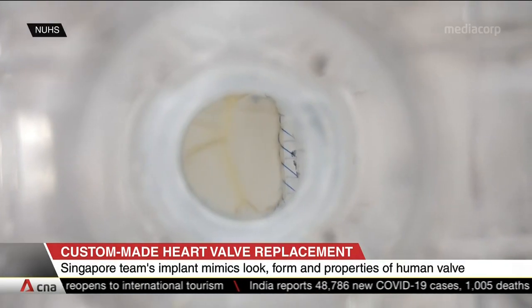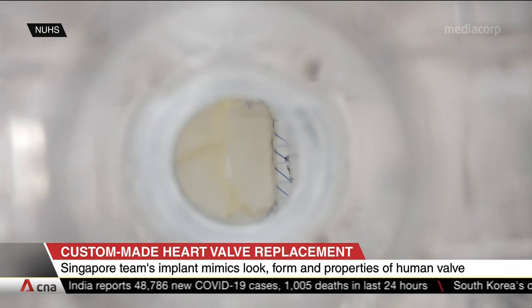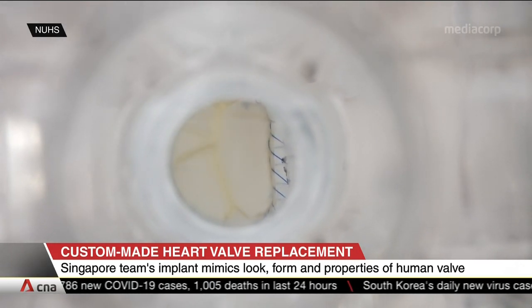A Singapore team has designed a heart valve implant that mimics the human part and is customizable. It's meant to be a better fit for patients who need a replacement because of heart valve disease. Made from either the patient's tissue or animal tissue, SingValve is designed to look and work just like the mitral valve in the left heart chamber.